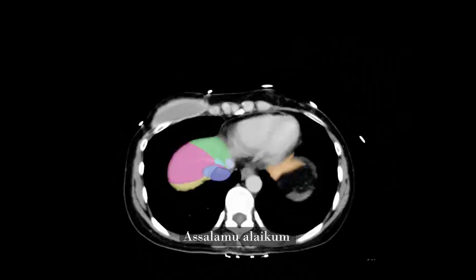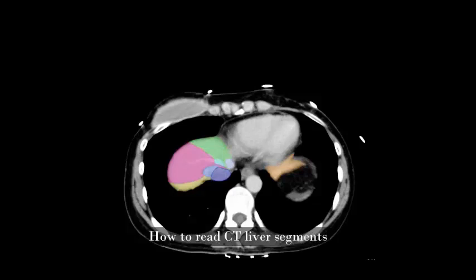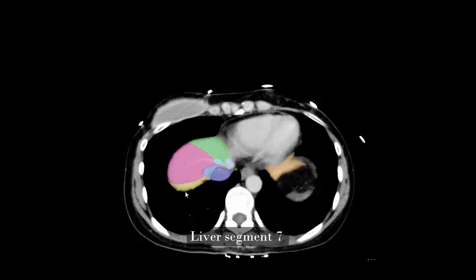Assalamu alaikum warahmatullah. Today I will share how to read CT scans of liver segments — liver segment 7.